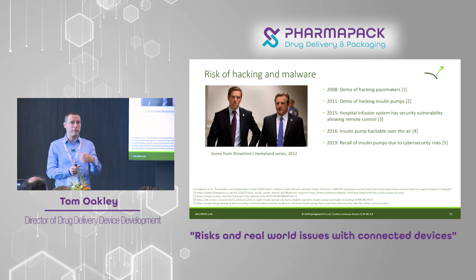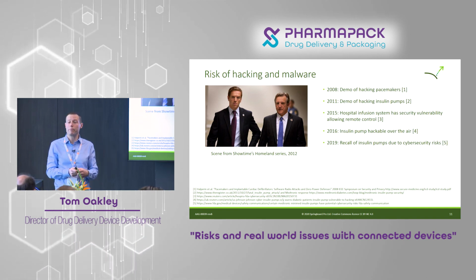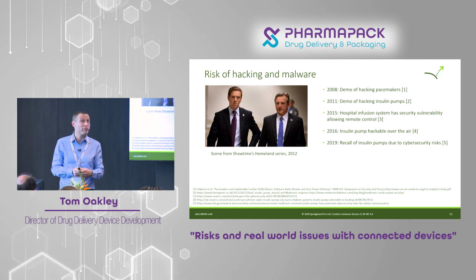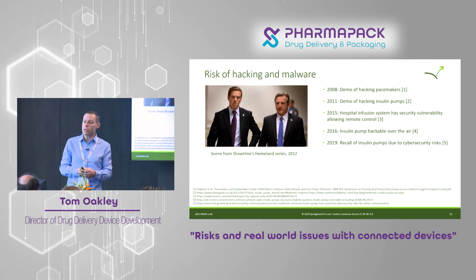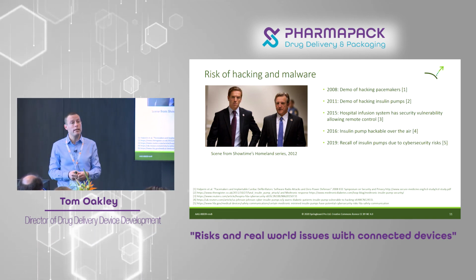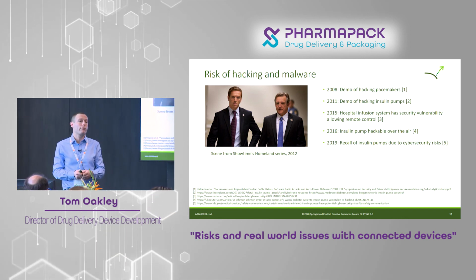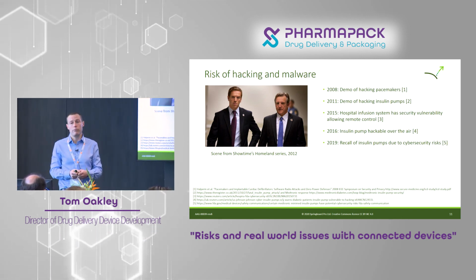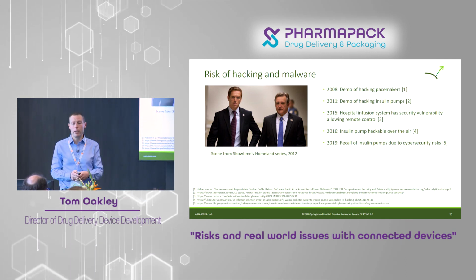All you had to know was what format the serial number was, and you just try 1,000 and you've probably got the right one. And the device will respond if you get the right one too. It'll come back and say hello, and you're in. So we've also got lots of examples of demos, and more recently, just last year, there was the first recall of a drug delivery device due to a cybersecurity risk, of the risk of hacking. It was recalled, taken off the market by FDA.